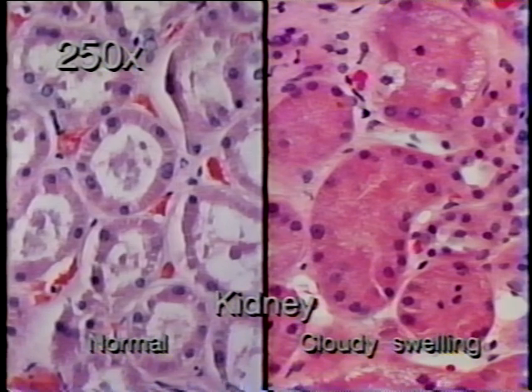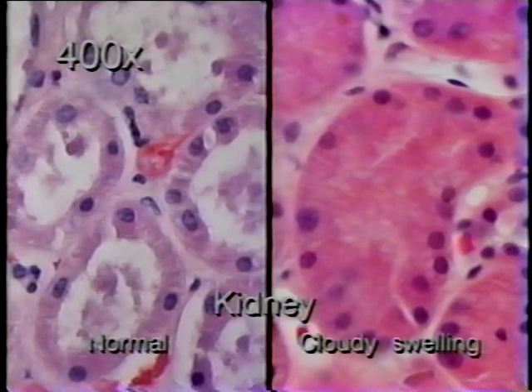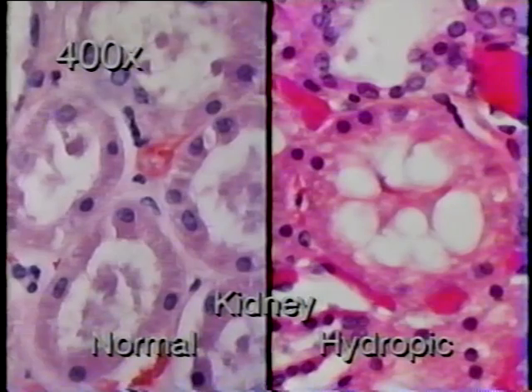If you examine the cytoplasm carefully, you should be able to detect very small clear vacuoles, which are subcellular organelles distended with water. Now you can see the same alterations at higher magnification. Here is another example that demonstrates more extensive cellular edema. Note the prominent water vacuoles. When cellular edema progresses this far, the condition is referred to as hydropic or vacuolar degeneration.